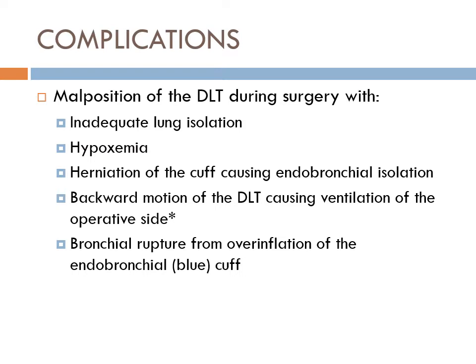There can be a lot of complications from double lumen tubes. So just remember, these are people with underlying lung pathology almost always. You can have some people who come in with random presentations that have normal lung mechanics, but think of this a couple of ways. You have mechanical issues with people. So your lungs, do they open and close? Do they passively exhale normally? Are they easy to ventilate and open up, right? Is it a problem with thoracic cage impedance to restrictive airway diseases, or is there something wrong with the elasticity of the lungs? So a mechanical perspective you have to take into consideration, but an underlying disease pathology to the alveolar capillary membrane is another thing you have to take into consideration.